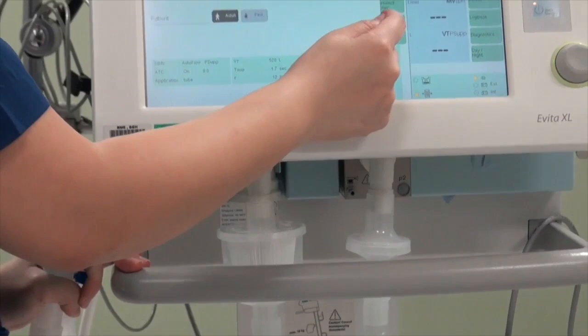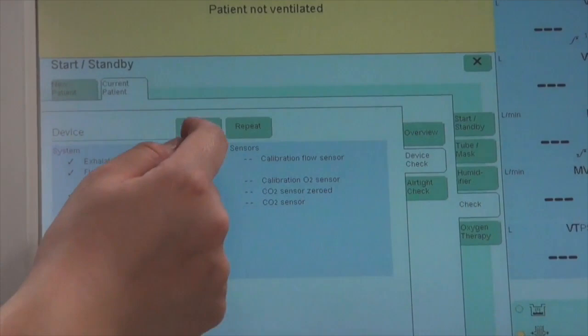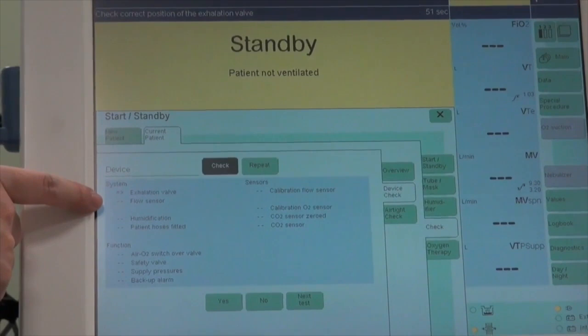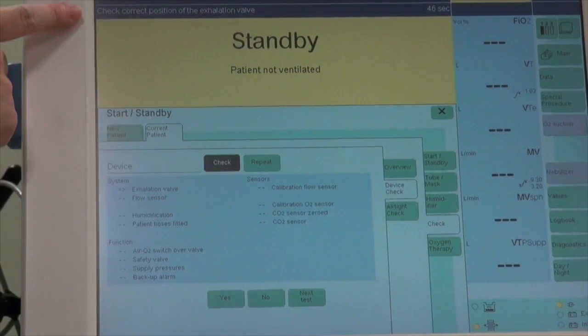After I've connected my patient circuit firmly, I go to Check, then Device Check, and click one more check here. Instructions for how to do the check will come up. Before a test is done, it either appears as dashes for tests not yet done, or double arrows for a test currently being performed.